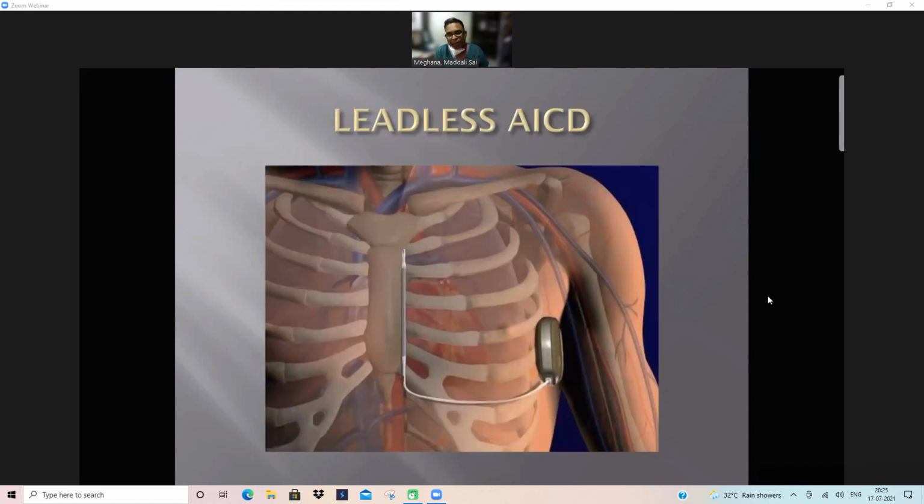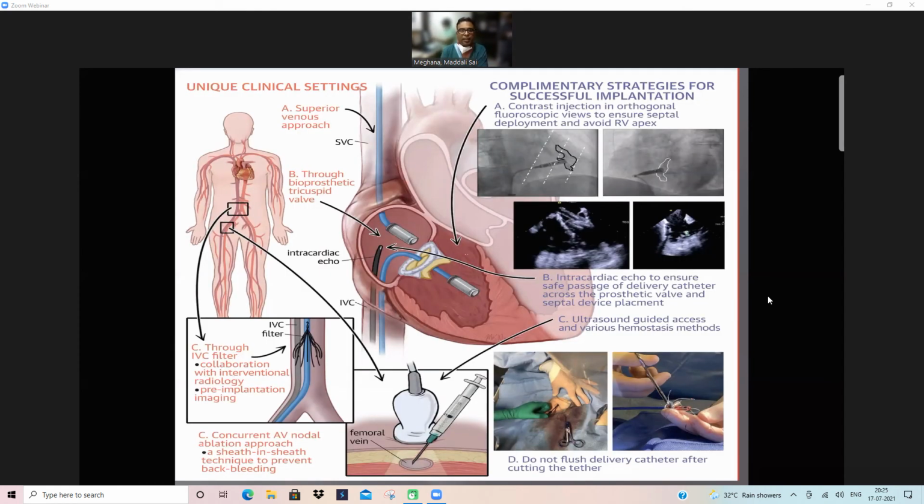And there are many times we have a concomitant device, like you can go with subcutaneous ICD, CCM therapy. If you have a CCM therapy and Micra, there is no problem. But if you have Micra and SICD or EV-ICD from Medtronic, you can have interactions between Micra and the subcutaneous ICD. So which one comes first? If you have a bradycardia, definitely Micra comes first. On top of bradycardia, if you get LV dysfunction, you need CRT, or ventricular tachycardia, you have to improvise what system you go for. You go for CRT-wise, completely wireless CRT in the LV, that is also a leadless pacemaker.